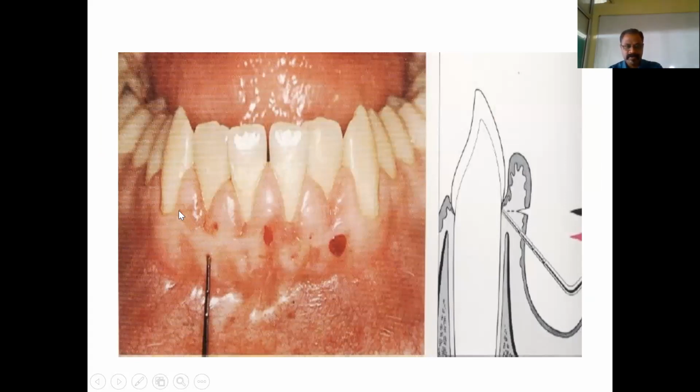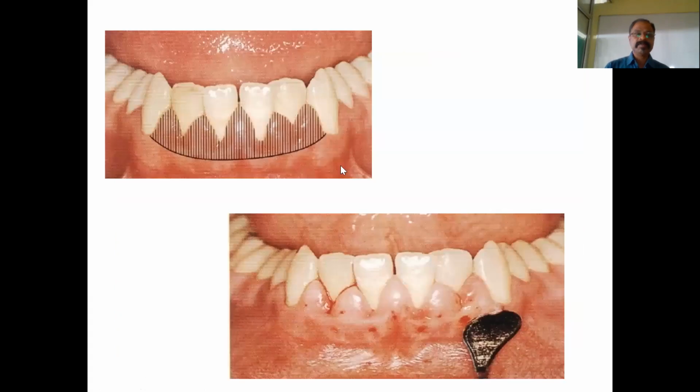Now you're going to join all these points into a line and make sure that your incision is more apical to this bleeding point. This is how it is shown diagrammatically. Now that you have made a bleeding point, your incision should be beveled at a 45-degree angulation to give that normal contour. Understand, right? So this much area has to be excised.